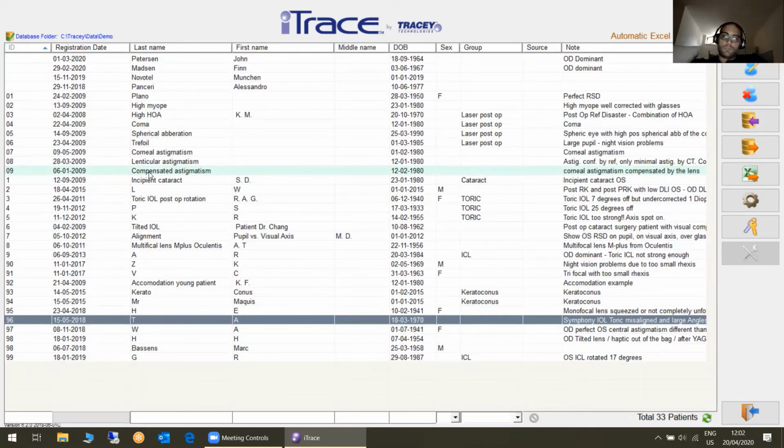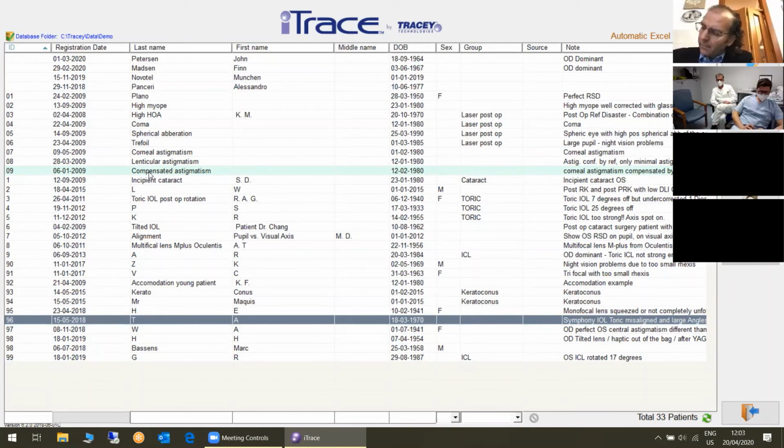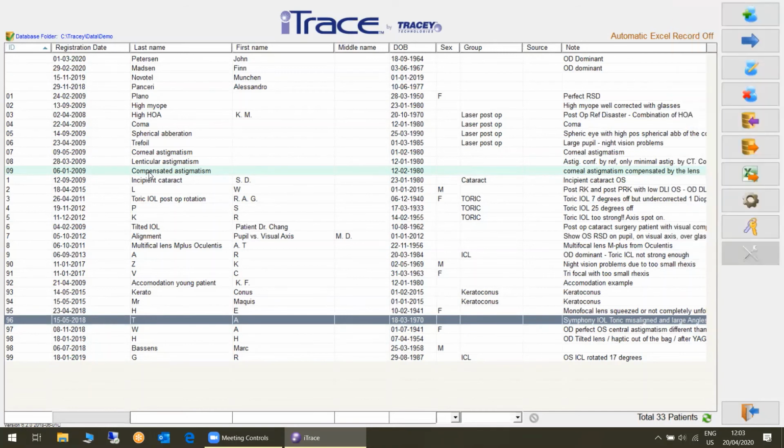The third group is all your post-op torics. Because in this way, and only this way, you can truly examine your surgically induced astigmatism. You can see if the calculation you're using is correct. You can see if the Barrett that you use is okay or not okay. So this is the only way to find out if what you are doing is good enough or the best.